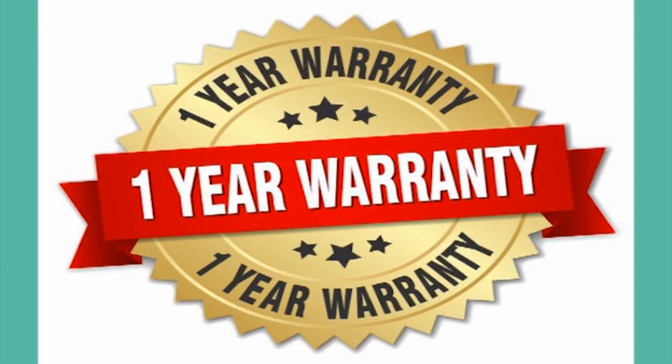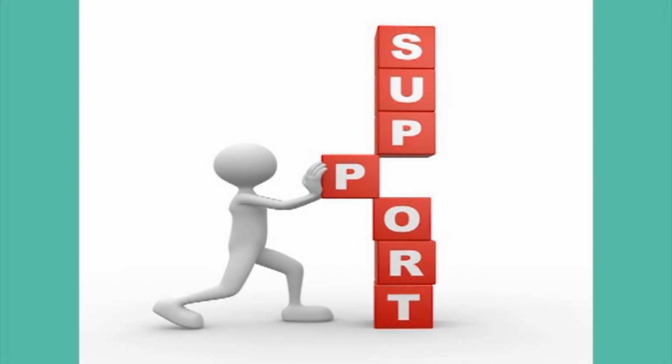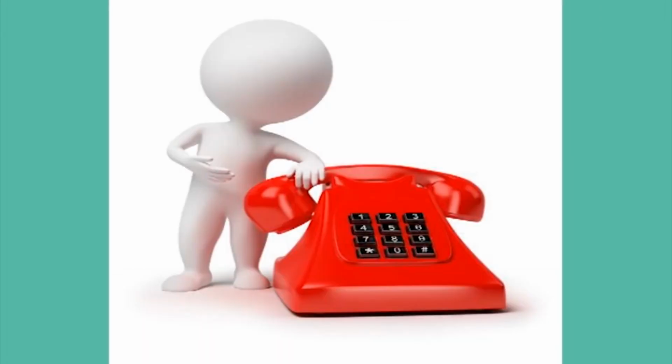To the next, we should see the support. What is the warranty available for the technology? How are repairs handled? For example, is there someone in your area? How will you get support if you need it? For example, a technician in the school, a local vendor, by telephone, by mail or remote access.